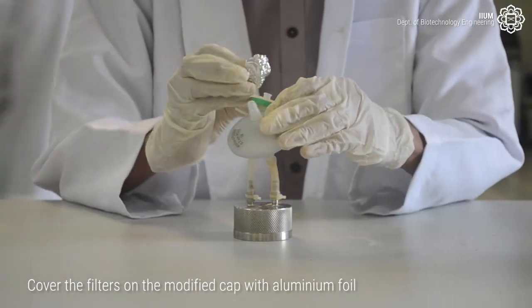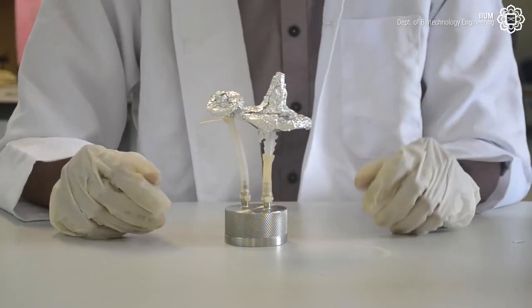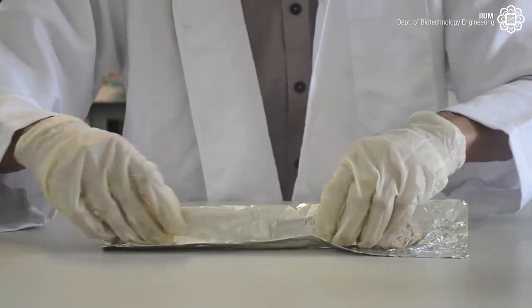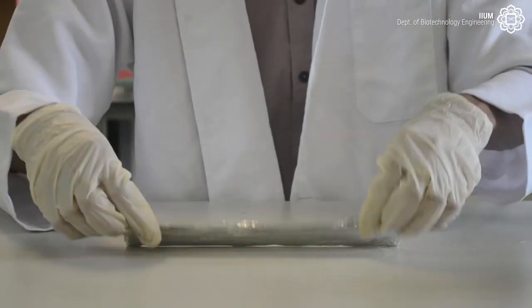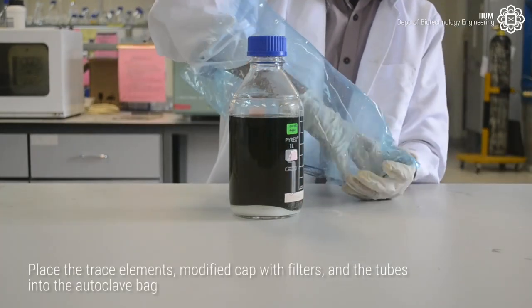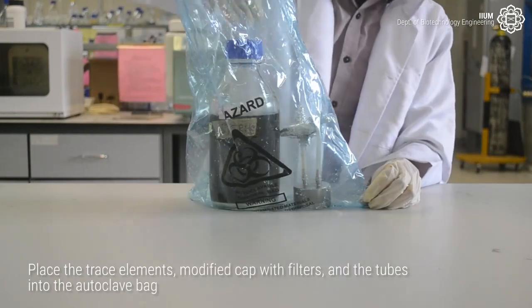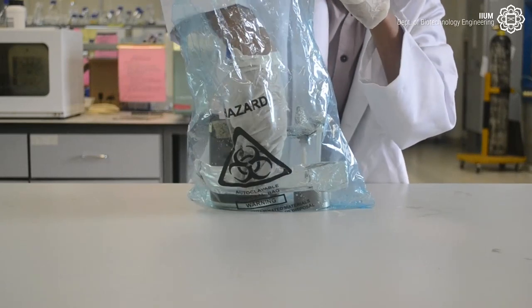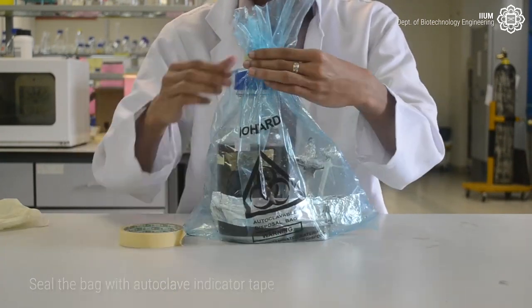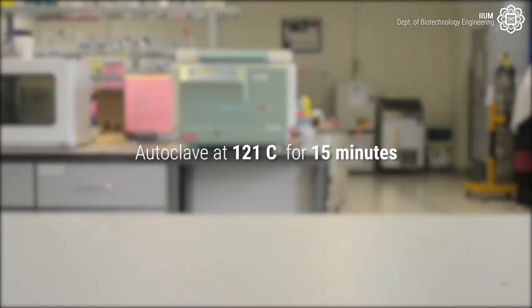Cover the filters on the modified cap with aluminium foil. Cover the tubes with aluminium foil. Loosen the cap. Place the trace elements, the modified cap, and the tubes into the autoclave bag. Seal the bag with the autoclave indicator tape.